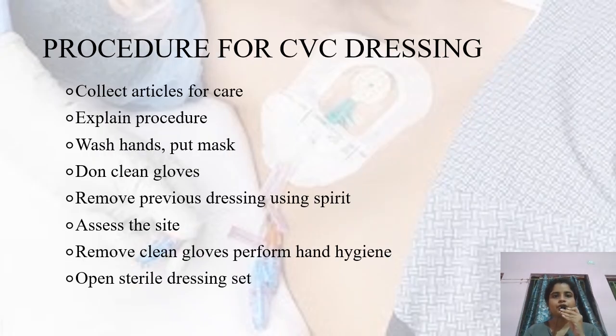Coming to the procedure, first you have to collect all the articles for care and explain the procedure to the patient if the patient's GCS is good. Then wash hands, put on the mask, don the clean gloves and remove the previous dressing. While removing the previous dressing, you need to look at the insertion site for any redness, edema, or any pain to the patient.